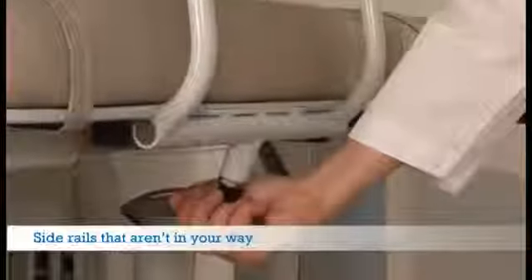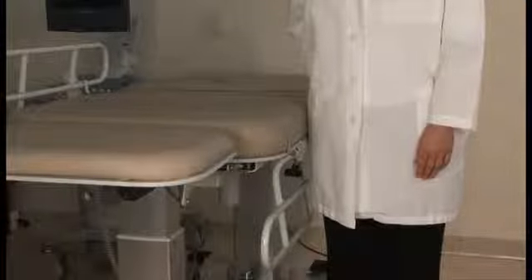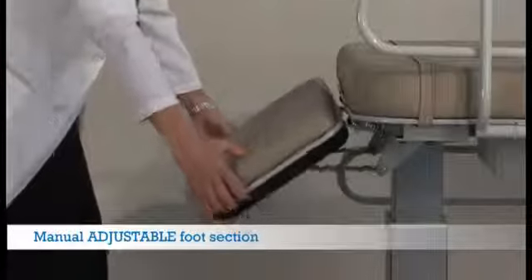When not needed, the simple-to-use locking mechanism allows the side rails to drop completely out of the way to ensure minimal reaching during procedures. Oakworks' manual adjustable foot section easily adjusts to four different positions.